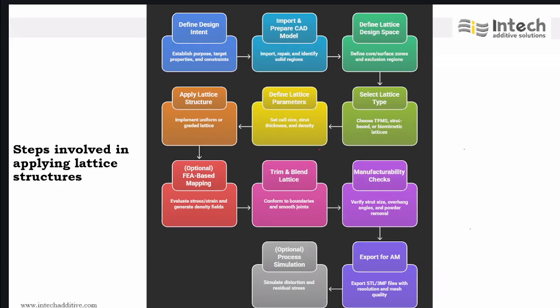The parameters define the properties of this. For example, if you take strut diameter, it actually controls the stiffness and weight.